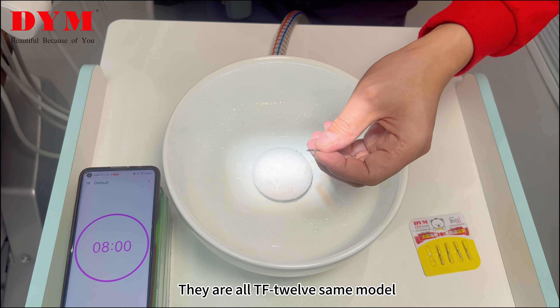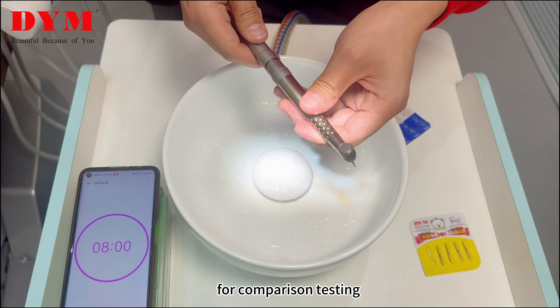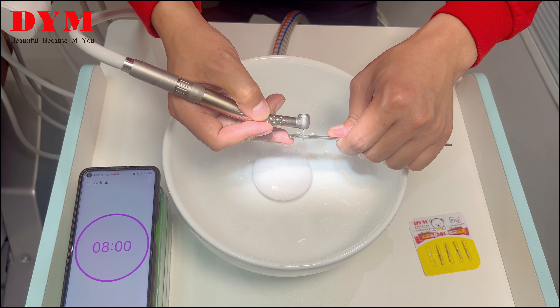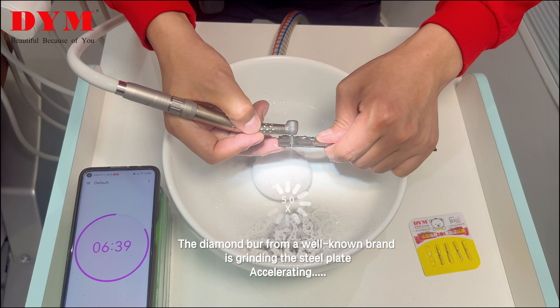Hello, today I will test the diamond bars for everyone. Using our DYM high-speed handpiece with quick connector, with the same air pressure and the same time. The width is 20mm, 8 minutes to test, grinding our 2mm thick stainless steel plate.